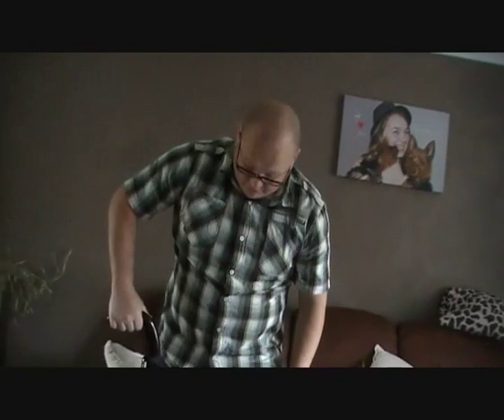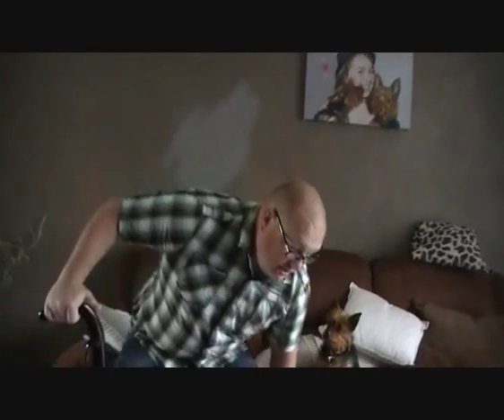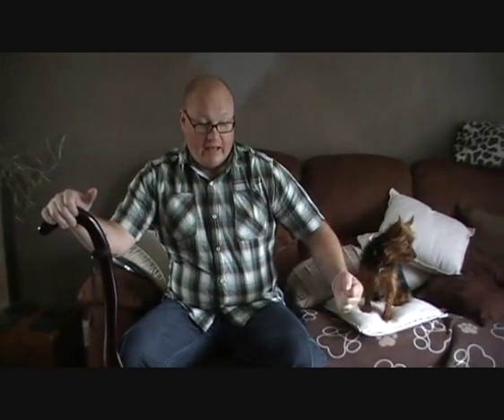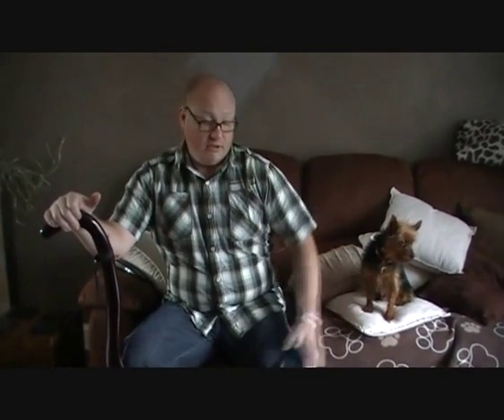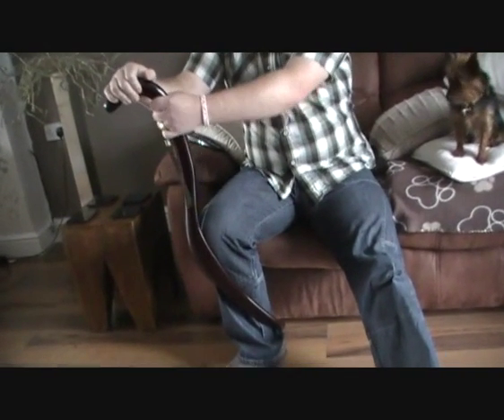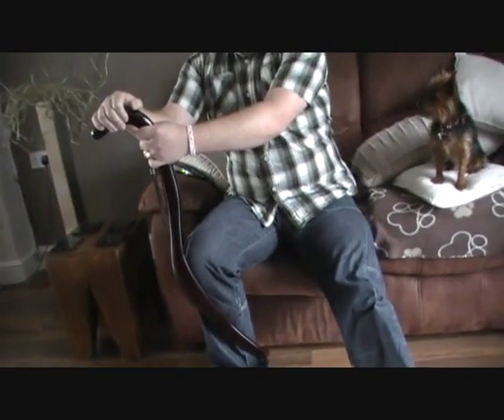It feels quite comfortable, very comfortable. A standard walking stick is just one stick — it's not stable, it can go on you at any time. With this you've got a lot of strength, a lot of stability, once you get your trust with it, which is pretty quickly.